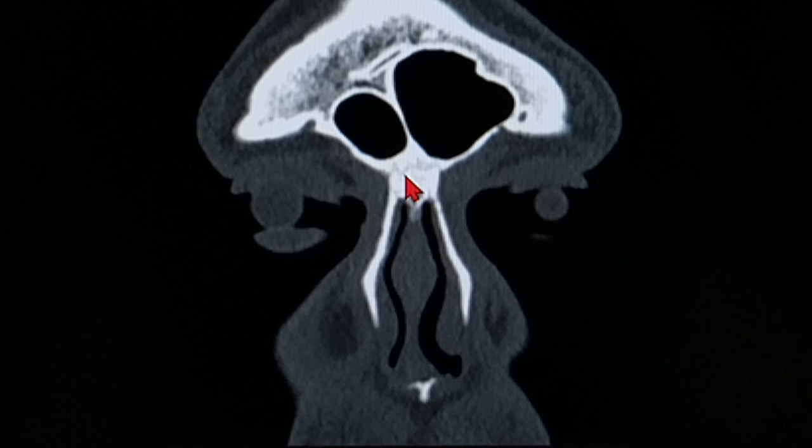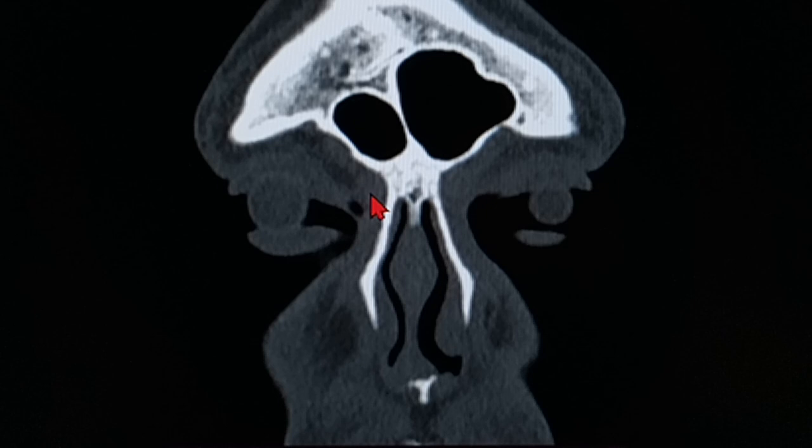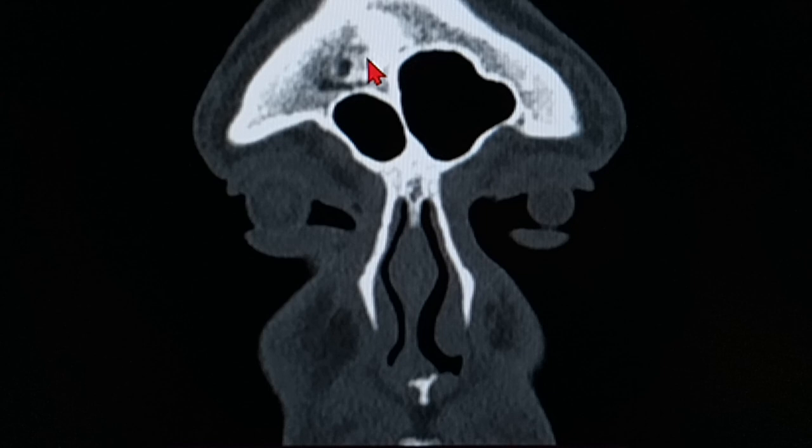So going behind, nothing much more on this scan. Let's go behind. You can see all the bone, internal structure of the bone over here. This maxillary part getting more prominent. You can see the perpendicular plate of the ethmoid much more clearly right now. And that's the right orbit, that's the left orbit. You can see the eyeball coming in the picture. And that's the bulbous part of the nasal septum.